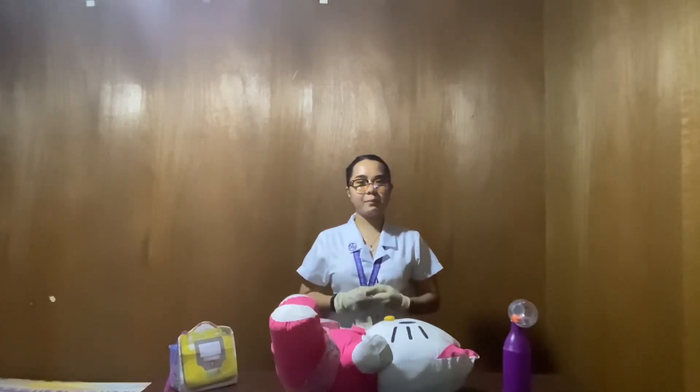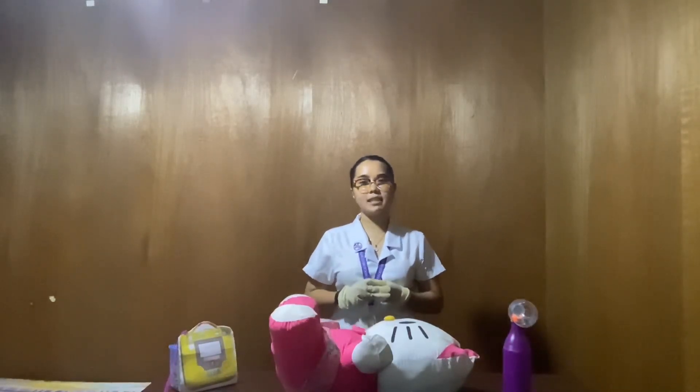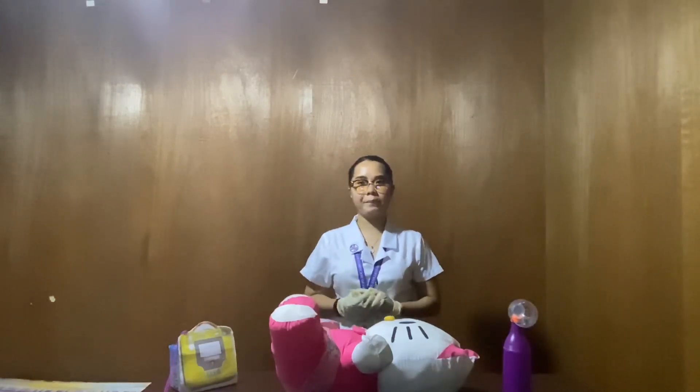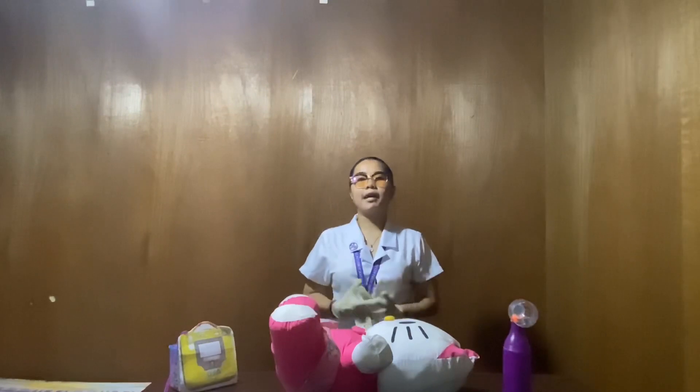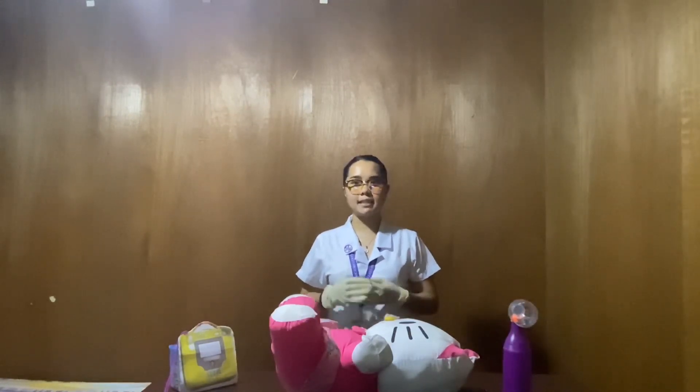Good day everyone. I am Katrina Allen A. Cordero from BSN 12 Section F and a student nurse from Daba Doctors College. Today I will be performing adult cardiopulmonary resuscitation and AED skills.